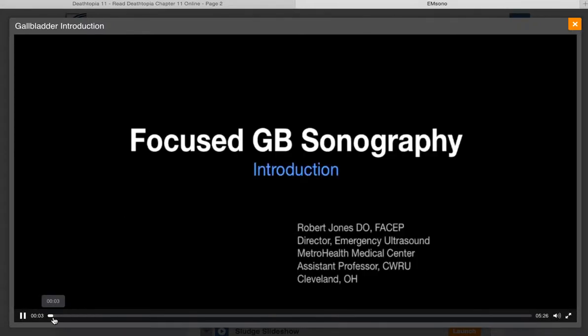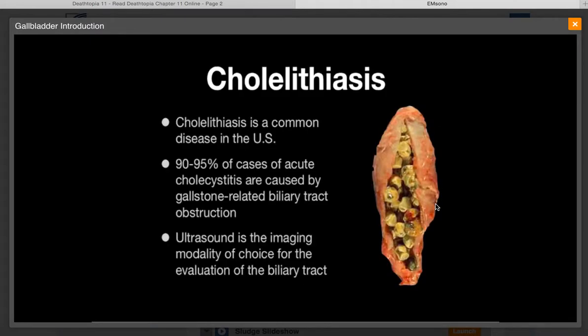Ultrasound is the imaging modality of choice on focused gallbladder sonography. Abdominal pain is a common cause for emergency department visits, and acute biliary colic or cholecystitis accounts for a significant number of these visits. Approximately 90 to 95% of cases of acute cholecystitis are caused by gallstone-related obstruction of the gallbladder neck or cystic duct. Therefore, focused gallbladder ultrasound is an important application for the emergency physician to master.